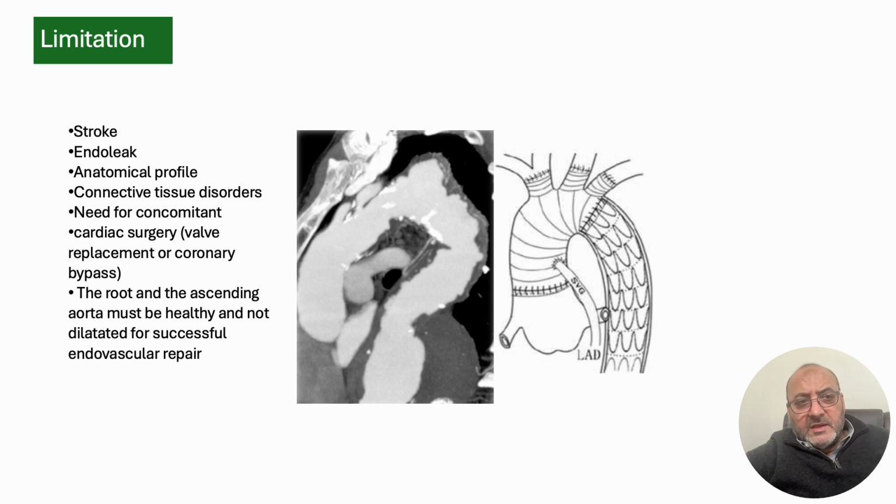As you know, the most advances have been done in the thoracic aorta endovascular. But for both open and endovascular treatment, one needs to be aware of the integrity of the tissue, whether the patient has connective tissue disease, dissection, redo surgery, aortic valve, mechanical valve, bioprosthetic.